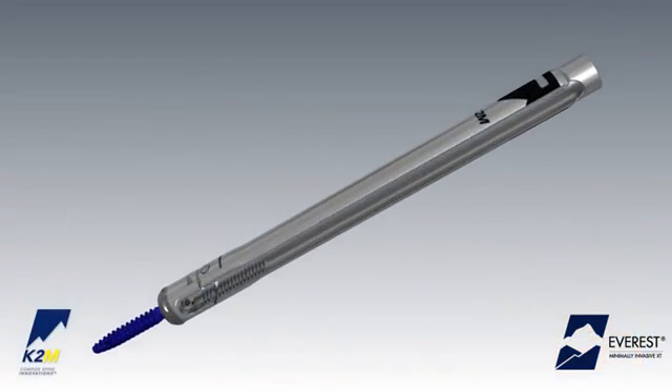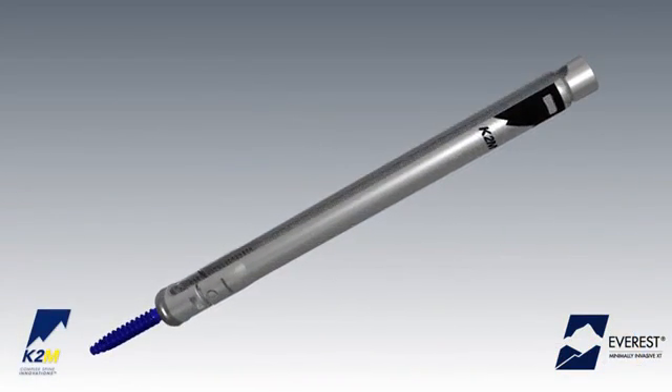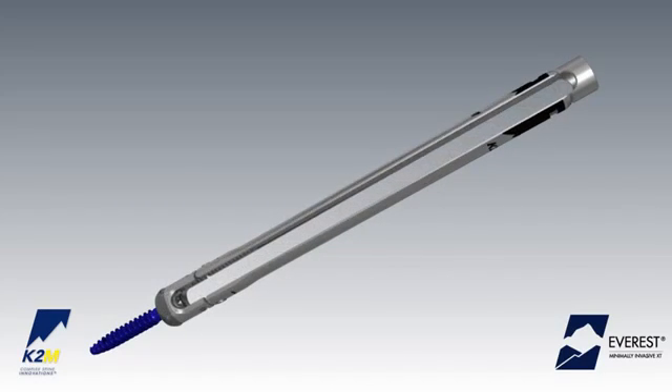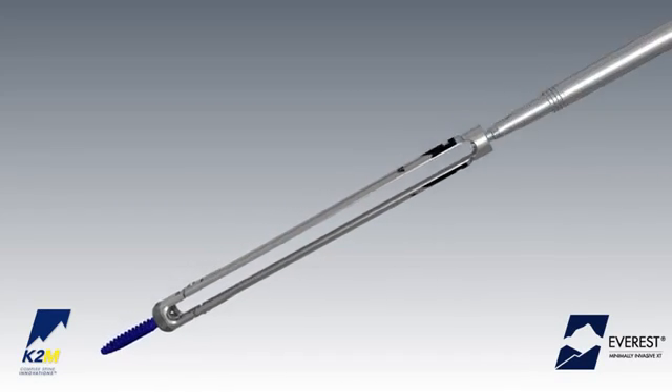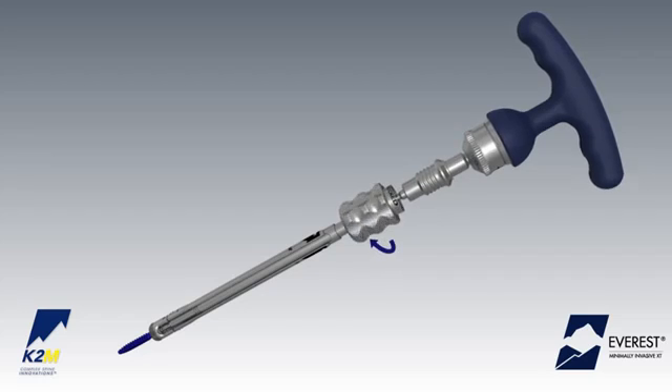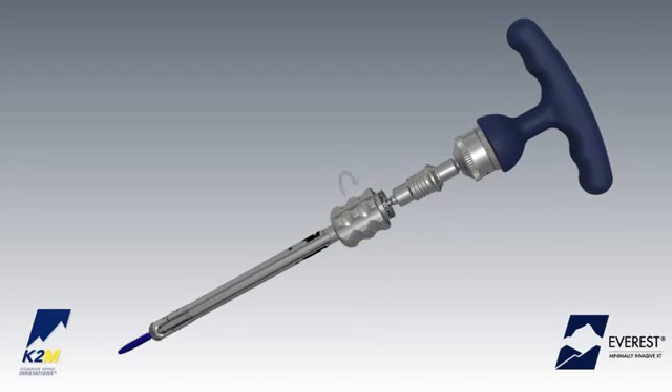Load the appropriate screw onto the Everest MIXT screw inserter. Grasp the implant by the shaft of the screw and apply a downward force to engage the screw into the hexalobe fitting of the Everest MIXT screwdriver shaft. First, thread the thumb knob in a clockwise direction until the implant is securely attached to the inserter.